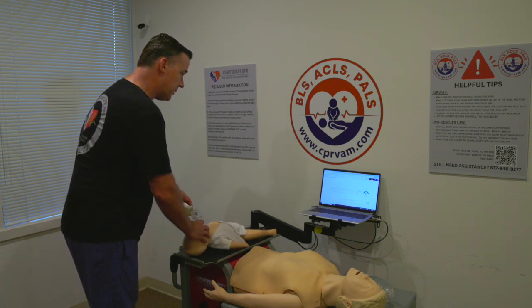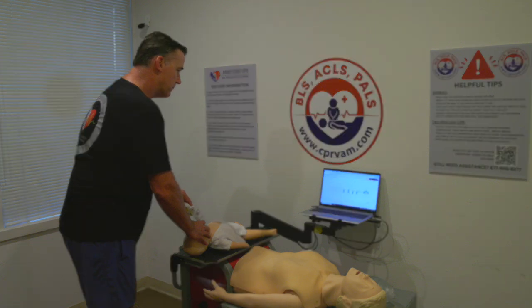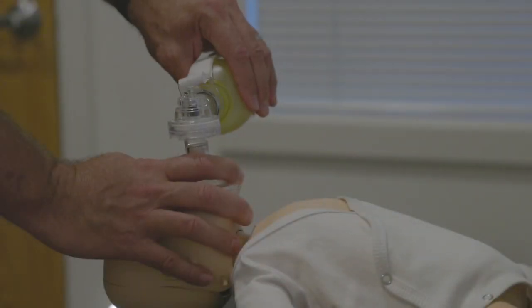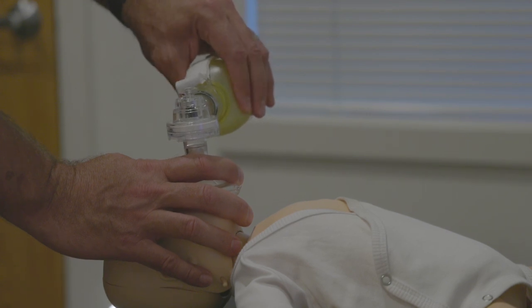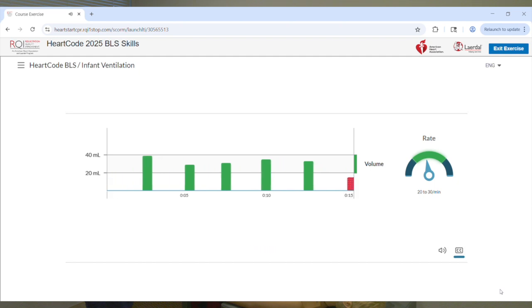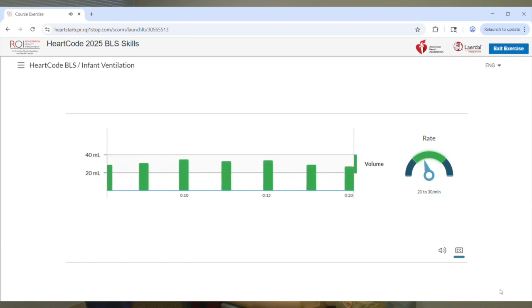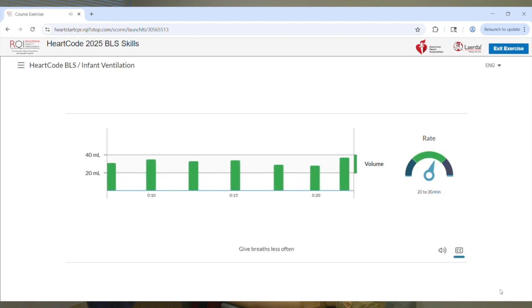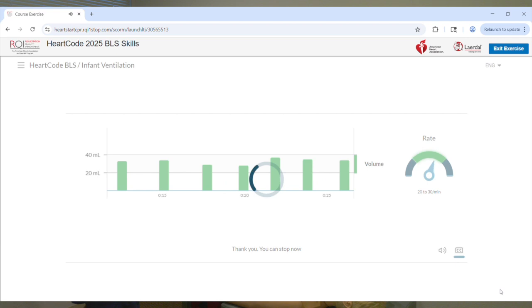Tilt the head back a little bit, get a good seal, and squeeze gently — not fast, squeeze gently. One breath every three seconds: one, two, breathe. See how I am barely squeezing? I'm just using my thumb to squeeze the bag — that's all the air we need. We don't want to squeeze super fast; we want to squeeze nice and easy, one every three seconds. Look at your results and continue.